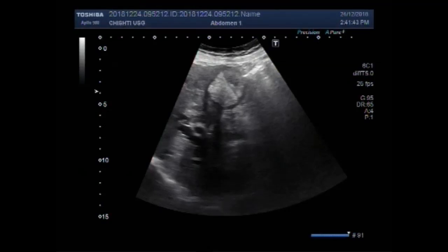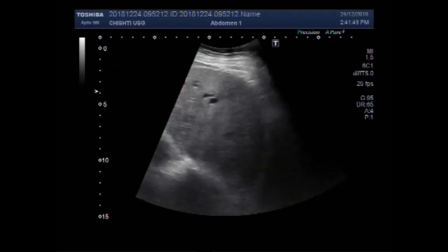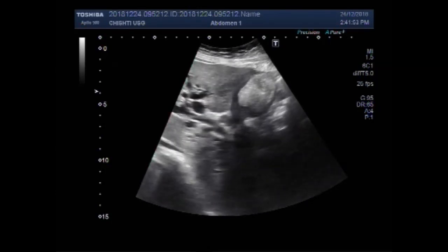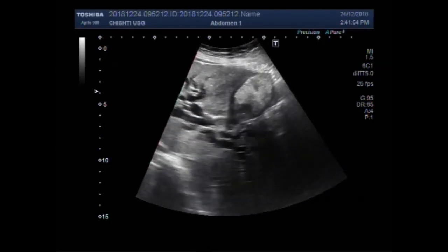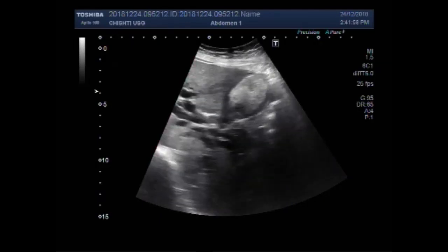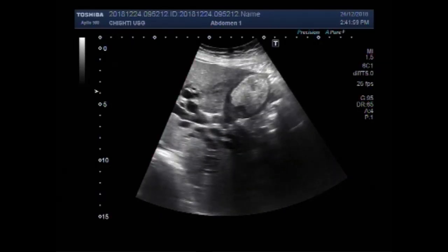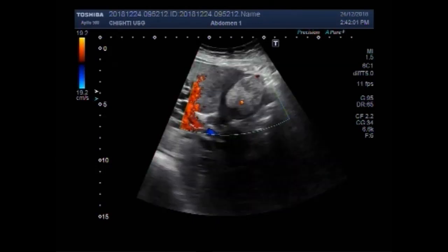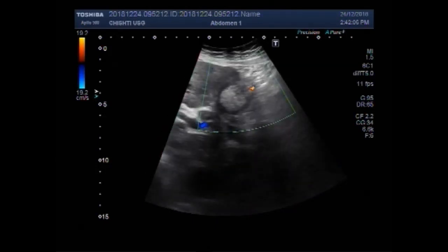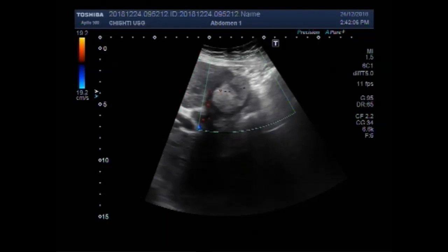Dear viewers, I hope you are all fine. This ultrasound video shows a mass in the gallbladder with the dilatation of the biliary channels due to the tributaries of the mass going into the biliary channels.